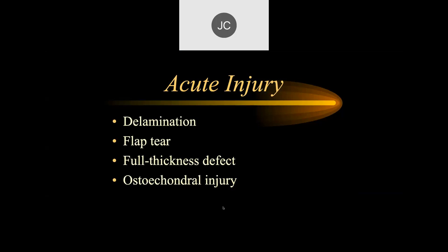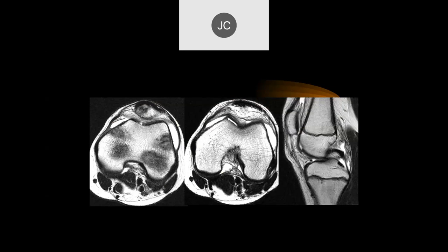Let's look at acute injuries to articular cartilage. You can get delamination, flap tears, full thickness defects with injury to the bone, and you can also get injury to the bone without cartilage injury. Here's a case showing a full thickness fissure in the articular cartilage where fluid undermines the cartilage — separation that typically goes through the calcified layer where the cartilage separates from the underlying bone. This is called a delamination injury.